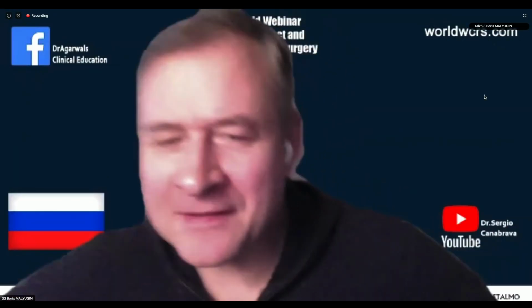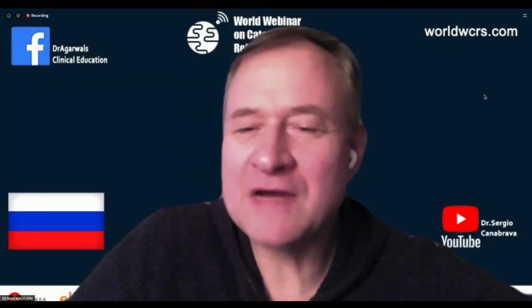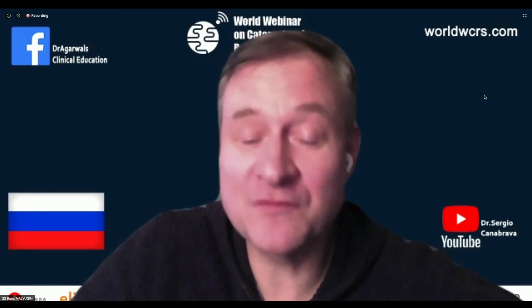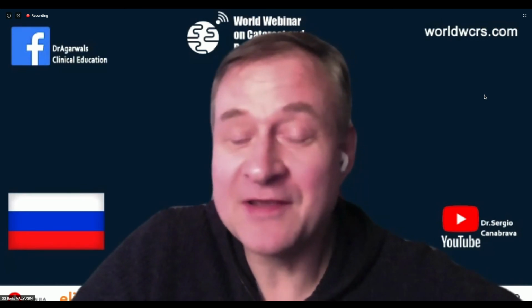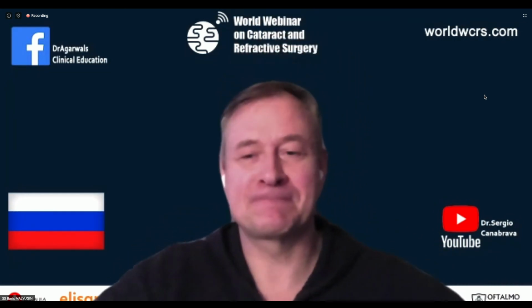Thank you, Ehud. I think this is the time for a short discussion. We have a couple of minutes. So my first question to Suven, because we do have a range of devices. There are different ones. So your device is planar, and it is very good because it can be inserted through the small incisions, 1.0 in your case. However, at the same time, a planar device makes it a little bit more challenging to engage the iris. So tell us about your tips and tricks, how you do it more efficiently.